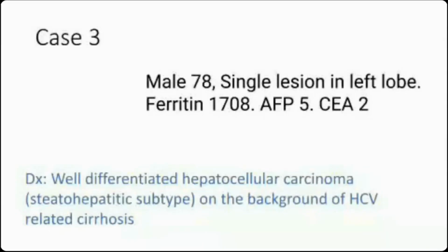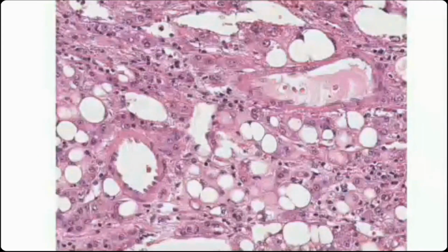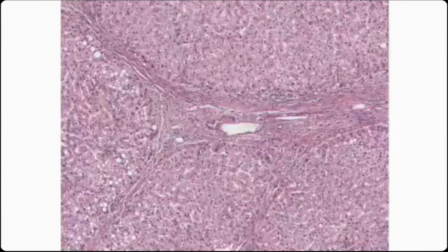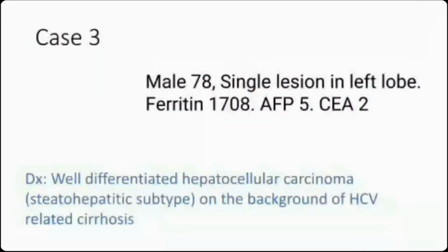Sorry, I didn't mean to ignore the chat. Someone's asked, how would you define atypical arterioles? The ones I've been talking about are unaccompanied arterioles. They're normal arterioles, small, medium size, that you find in lesional liver. When I'm talking about atypical arterioles, I'm talking about the type you find in focal nodular hyperplasia.